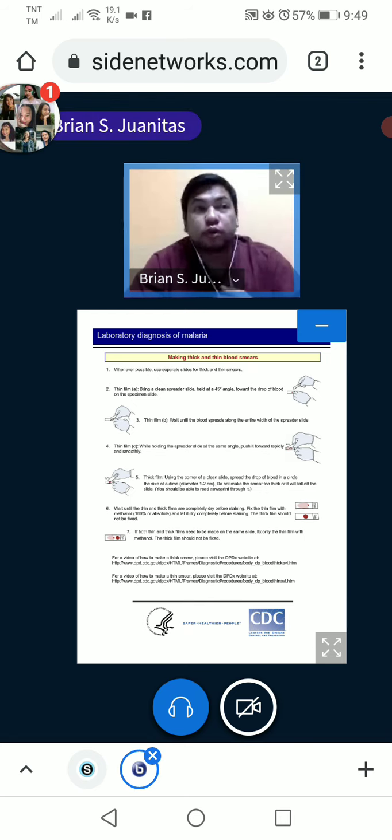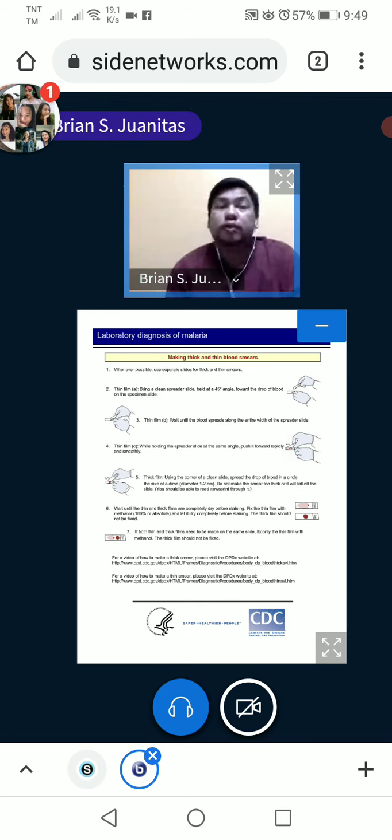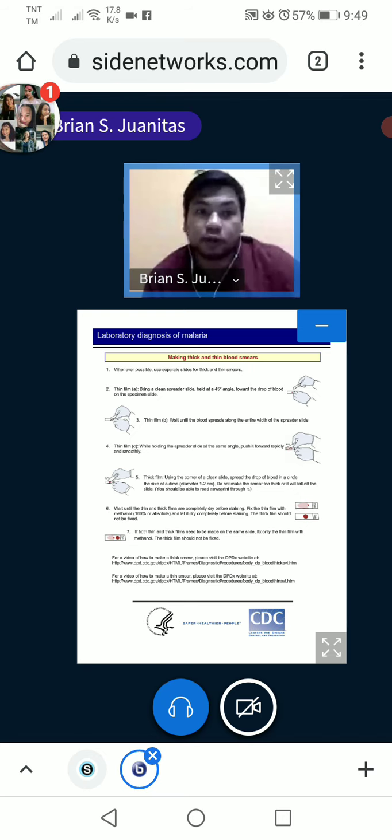Okay? So, yun ang proper way or yun yung technique na ginagawa namin sa laboratory, no? So, iisang slide, 2 smear na. Okay? If, for example, malaki yung drop, so 2 drops lang, okay? Wipe the first drop na lumabas and then start with the second, okay?